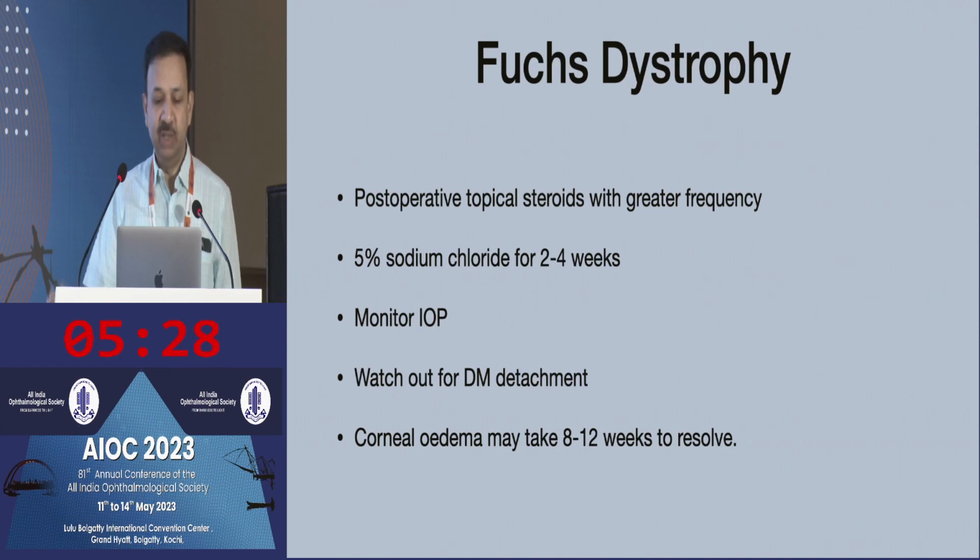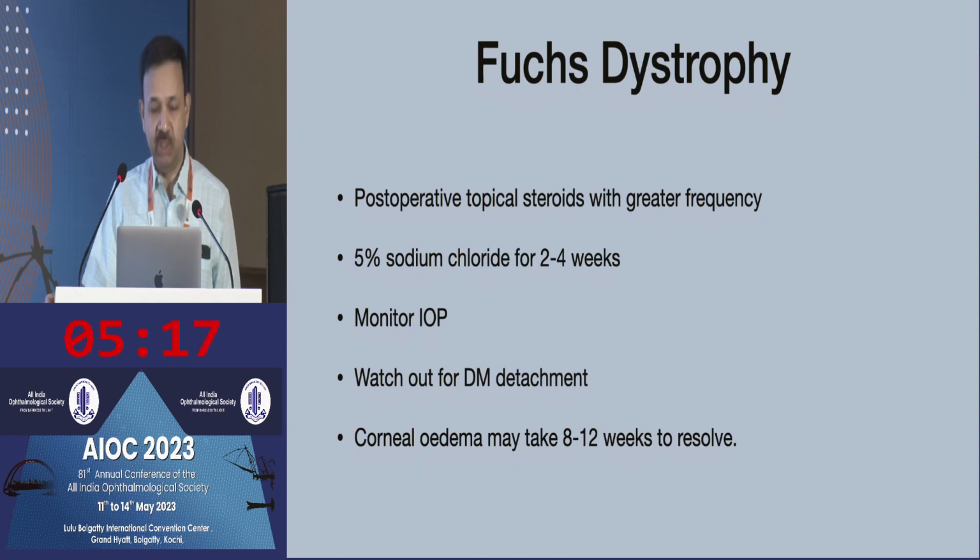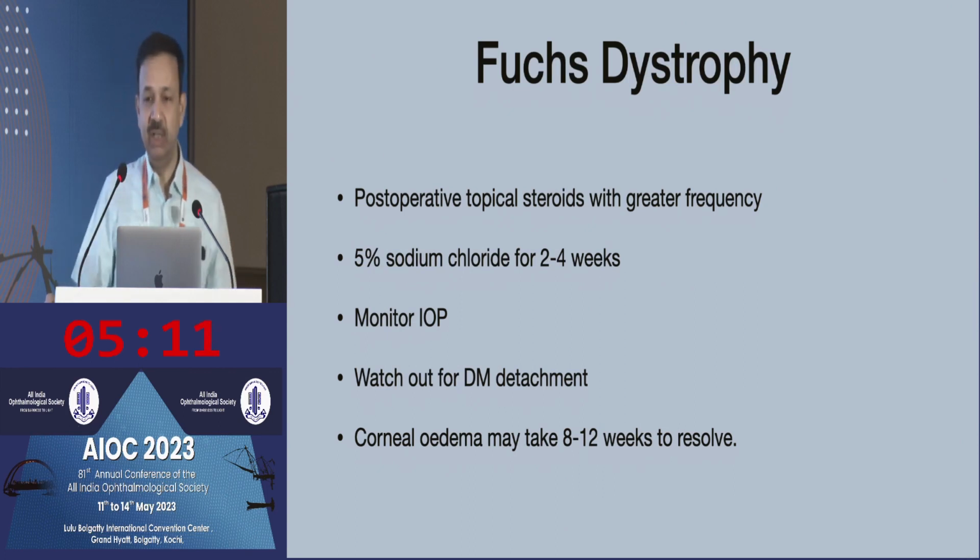So plan and tell them preoperatively that your vision on day one may not be very clear. You may need to use some medications for a longer period of time. Use topical hyperosmotics. Monitor the IOP, because raised IOP also reduces the function of the endothelial cells. Watch out for DM detachment. If there is edema, do an anterior segment OCT, because on slit lamp examination sometimes you may not pick up those shallow detachments, whereas on OCT you can pick them up.